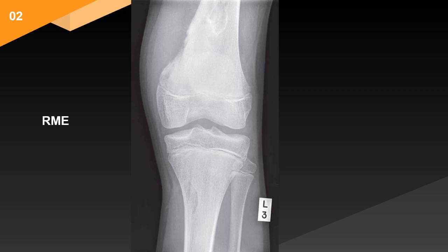In the lateral aspect of the proximal tibial metaphysis, there is a well-defined lucent lesion. The margins are clearly defined but not sclerotic, with a narrow zone of transition. It does not appear expansile and there is no visible matrix calcification. Within the lesion, there is no periosteal reaction, soft tissue mass, or other aggressive feature.